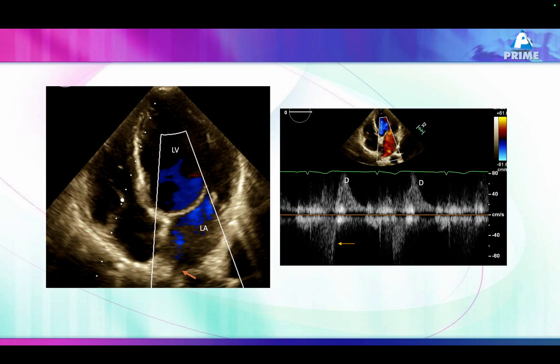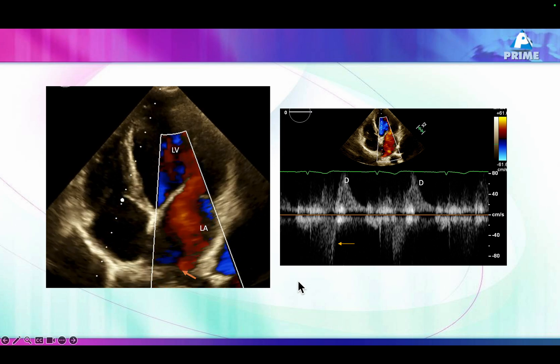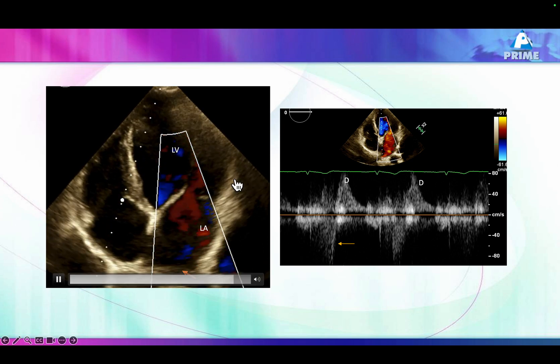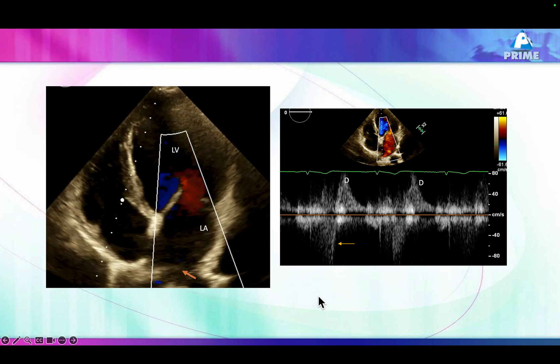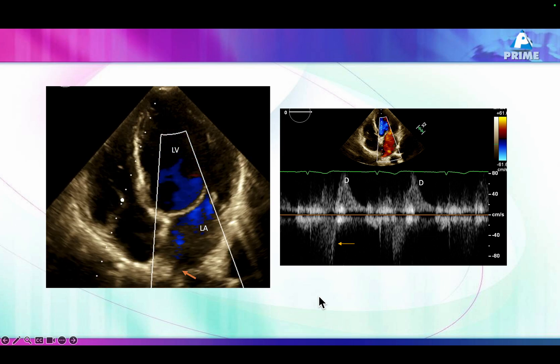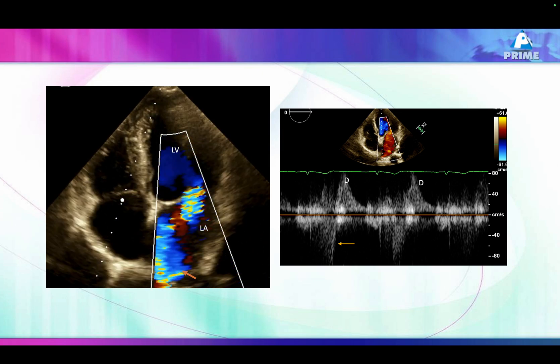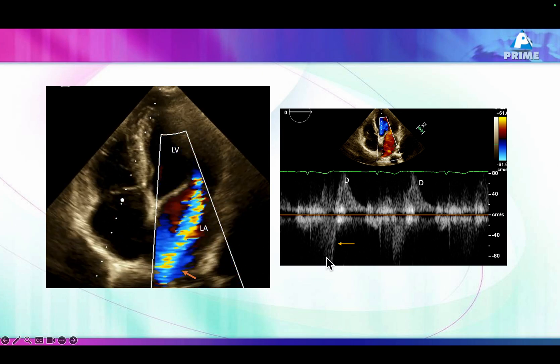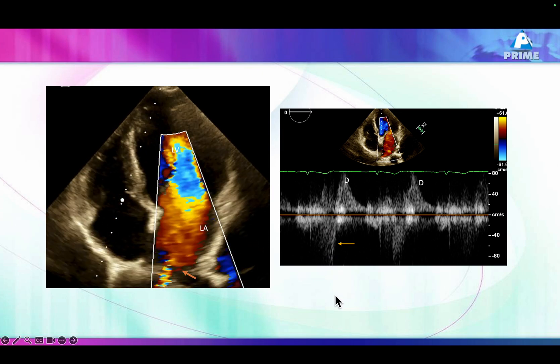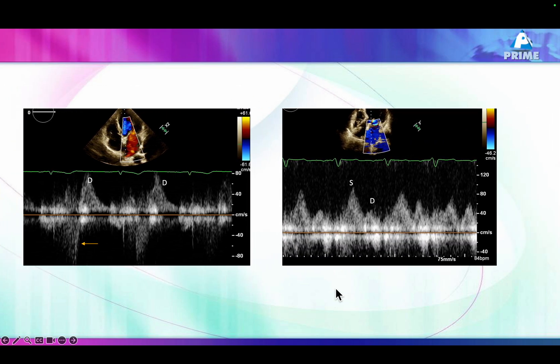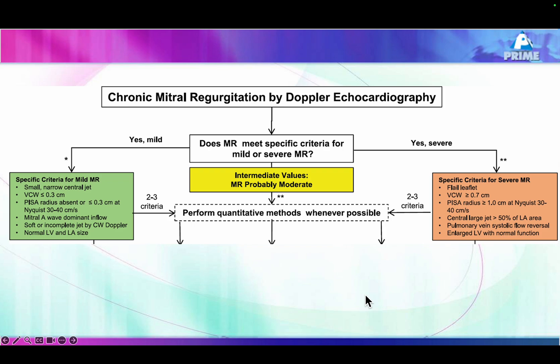The last method for assessing MR severity is pulmonary venous flow. In this example, you can see a severe mitral regurgitation jet entering into the pulmonary vein, and look at the pulmonary venous flow — it is reversed in systole. Compare this with our case, where the S wave was prominent, which cannot happen in patients with severe mitral regurgitation.